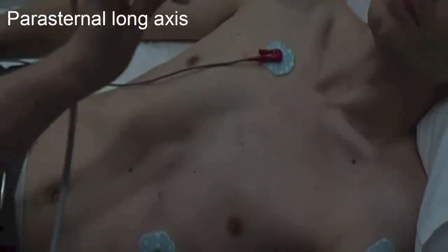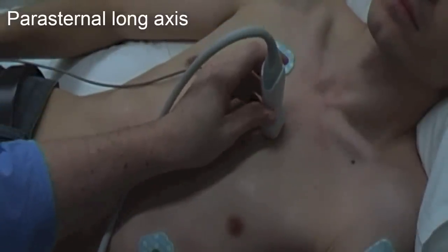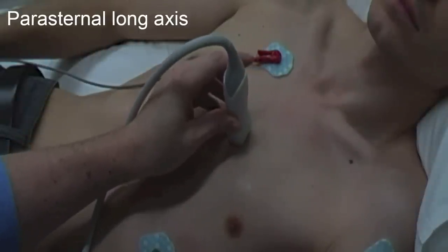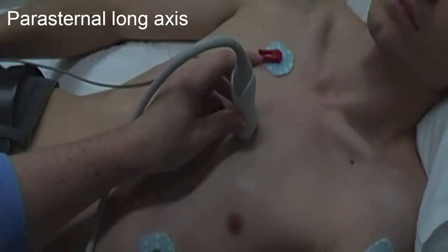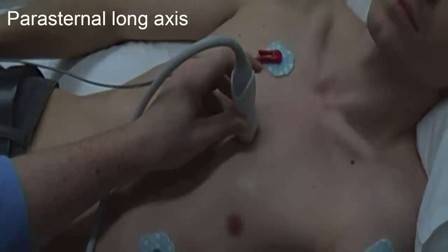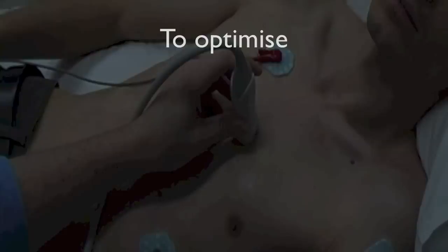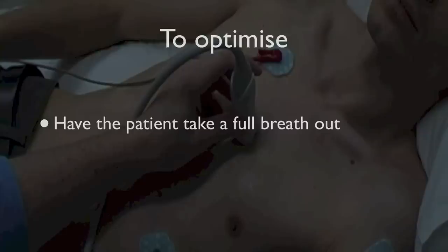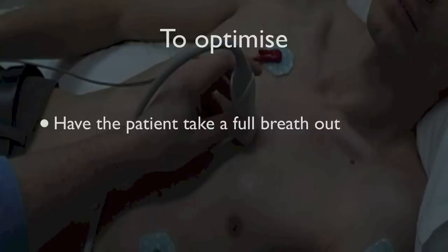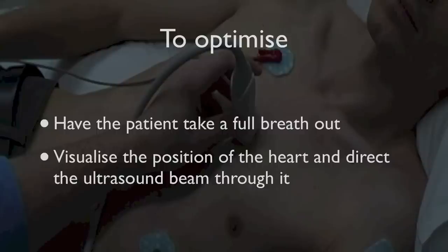The parasternal long axis: position the probe marker towards the patient's right shoulder. Start in between the third or fourth intercostal space in the left parasternal position and continue to move down a rib space until you can achieve an adequate view. You may need to get the patient to take a full breath out to collapse the lung to improve your image. It's important to visualize where the heart may be positioned within the chest and direct your ultrasound beam towards the heart.